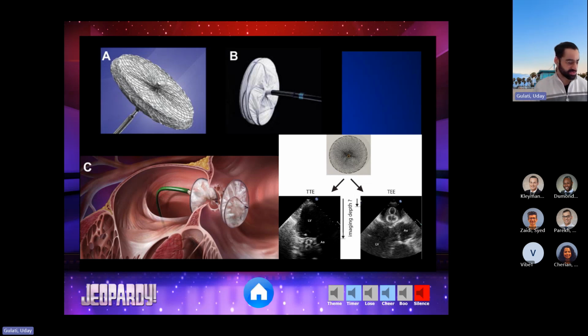And it's like the only time you'll ever see this finding. Your valves, like your mitral valve replacement, will look profoundly different. Your left atrial appendage occlusion devices will look profoundly different. They all have their pathognomonic findings that you should be aware of so you can identify what's going on.